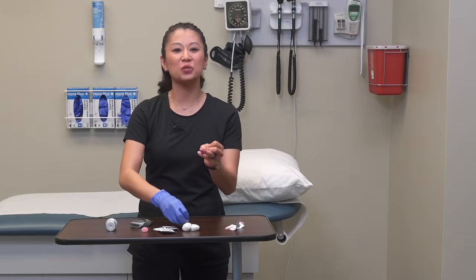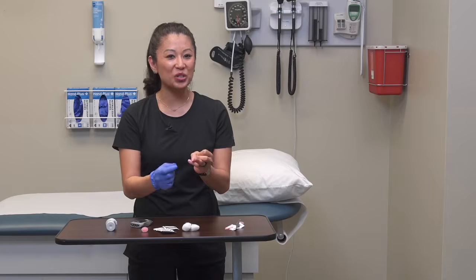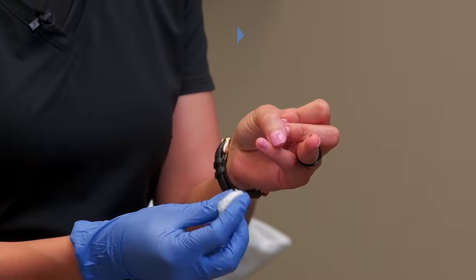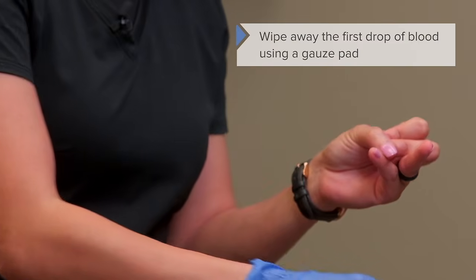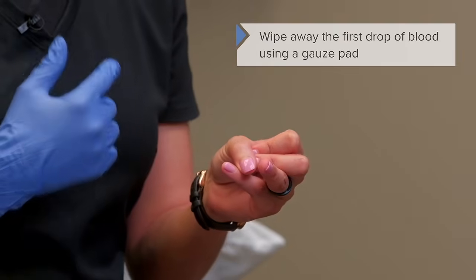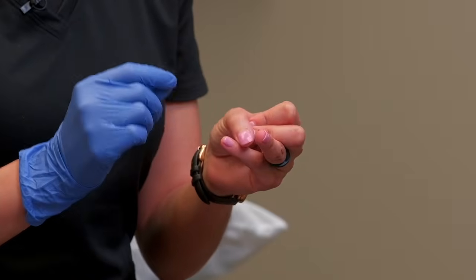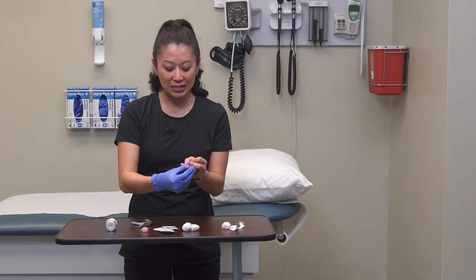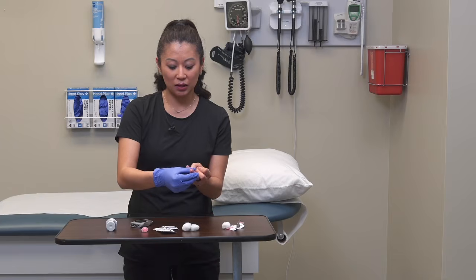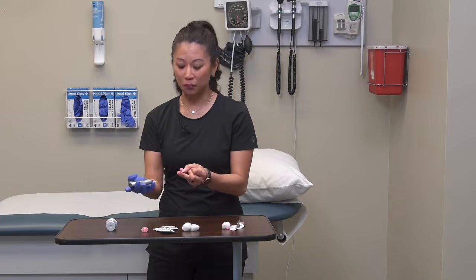So once you've done this, you see that I've got a drop of blood here, which is great. We don't want to squeeze too hard. I'm just going to squeeze lightly and make sure I wipe the first drop of blood off. Now this, as you can imagine, may have some of the alcohol from when we cleaned, and dirt and debris. So we want to make sure we take off that first drop of blood. Now it's not a bad idea to make sure you have an ample amount of blood. It's okay to lightly, as you see, compress the finger, not squeeze, to get enough sample to fill our test strip.